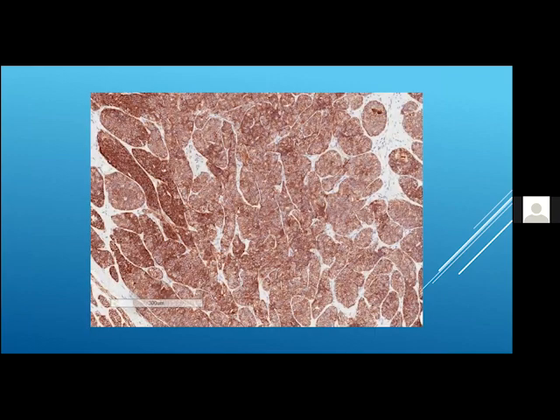Is it really atypical ductal hyperplasia or ductal carcinoma in situ within adenosis? Or is it lobular carcinoma in situ? And there was some suggestion of whether it could be adenoid cystic carcinoma or a salivary gland tumor. So now you rely on the immunohistochemistry, and this is E-cadherin. Everything was staining positive for E-cadherin, so it's not lobular, as you can see.